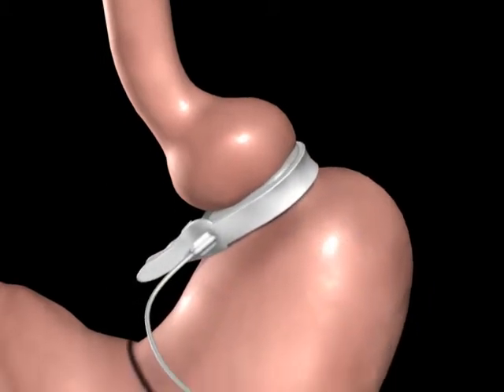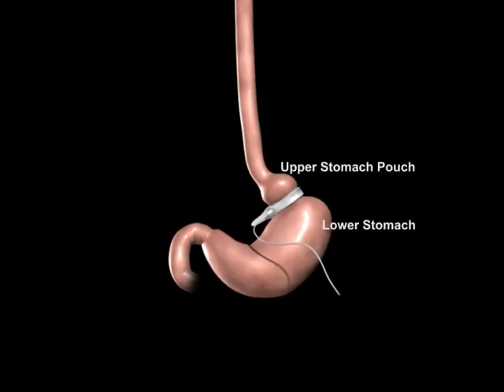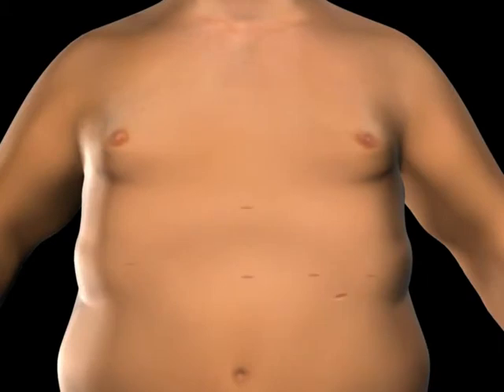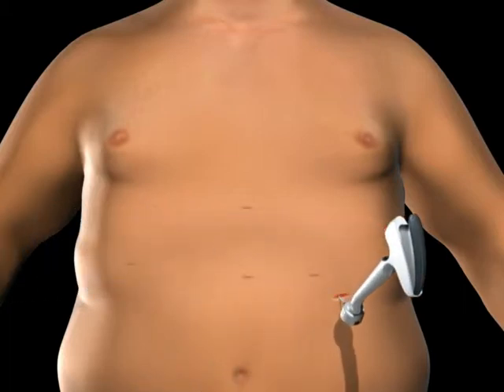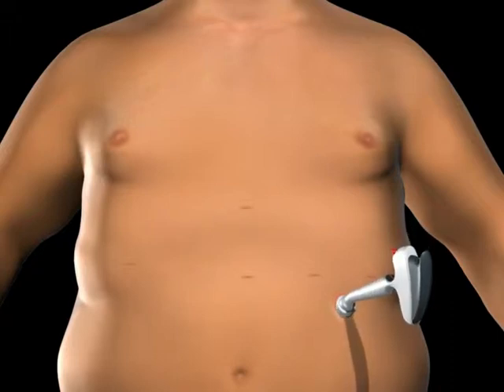A tube attached to the Realize band is connected to the injection port, which is used to adjust the band tightness after surgery. An incision is made on the upper abdomen to insert the Realize injection port beneath the skin. The tube is secured using the locking connector on the port, and both the injection port and tube are placed beneath the skin.